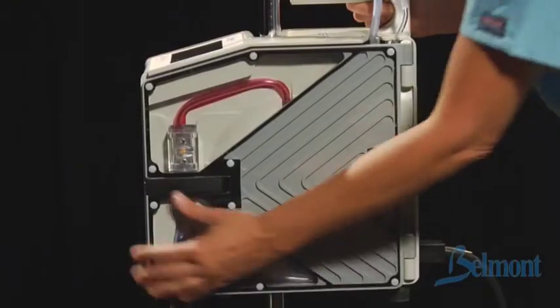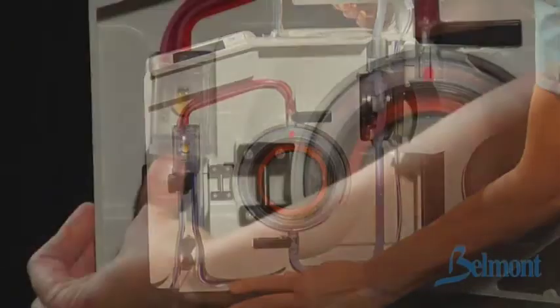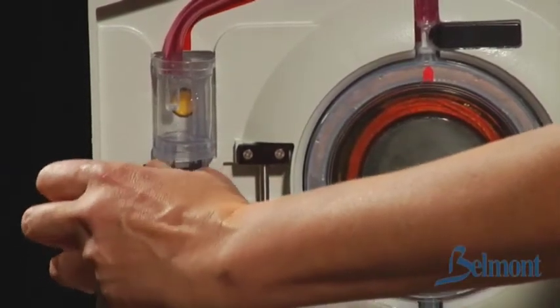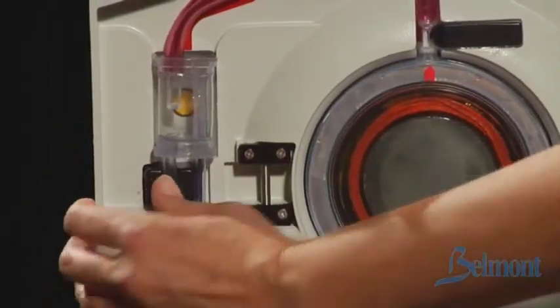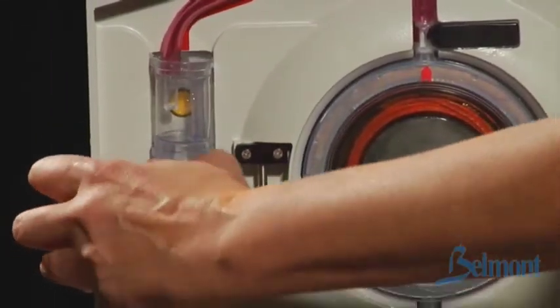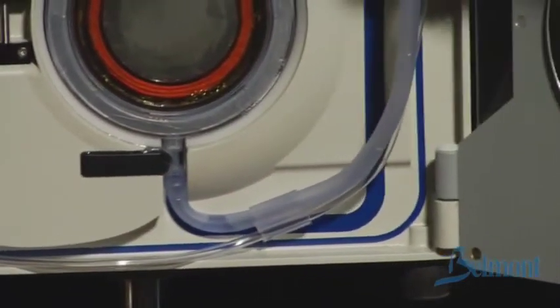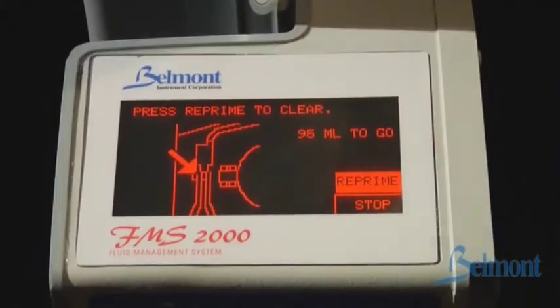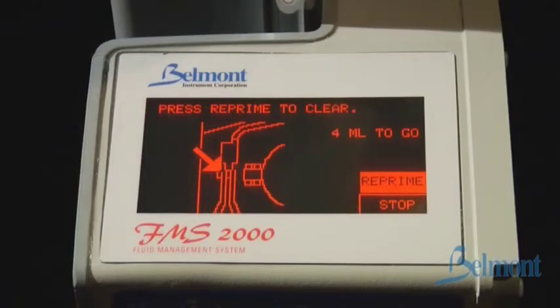First, open the door to silence the alarm. Check for air bubbles or leaks. Squeeze the tubing directly below the air detector to clear any trapped air out of the sensor. Check the air detector and make sure that it is clean and nothing is obstructing the sensor. Re-seat the tubing in the air detector, making certain it is firmly seated. Finally, press reprime. The system will resume infusion when the repriming process is complete.